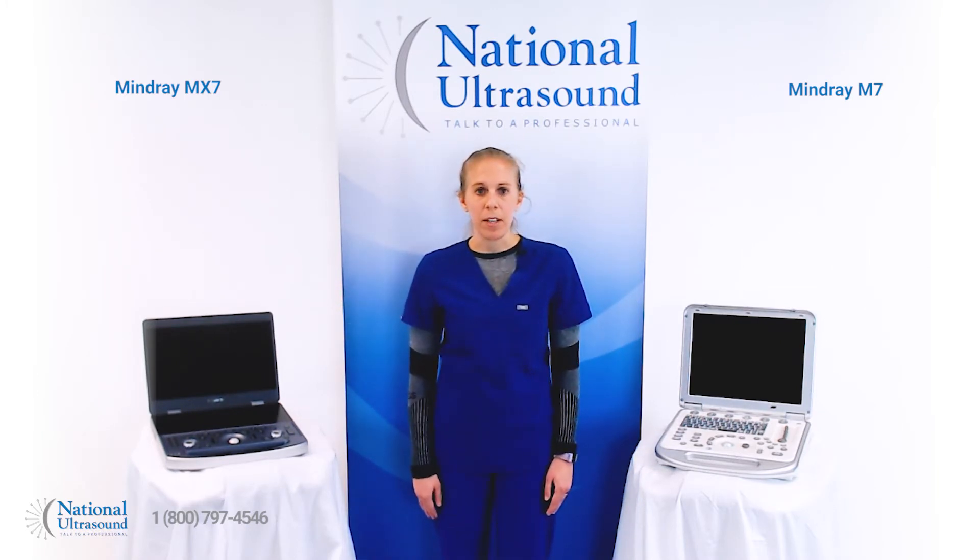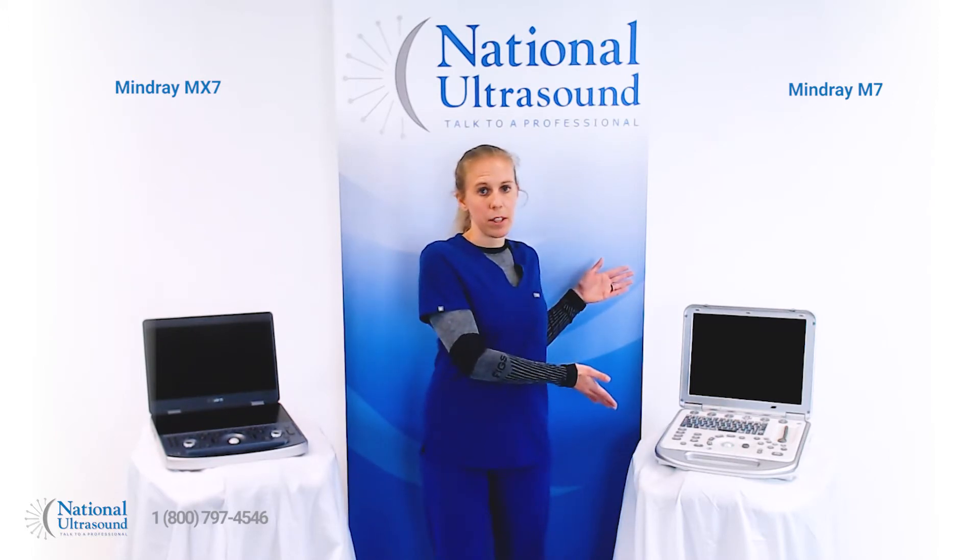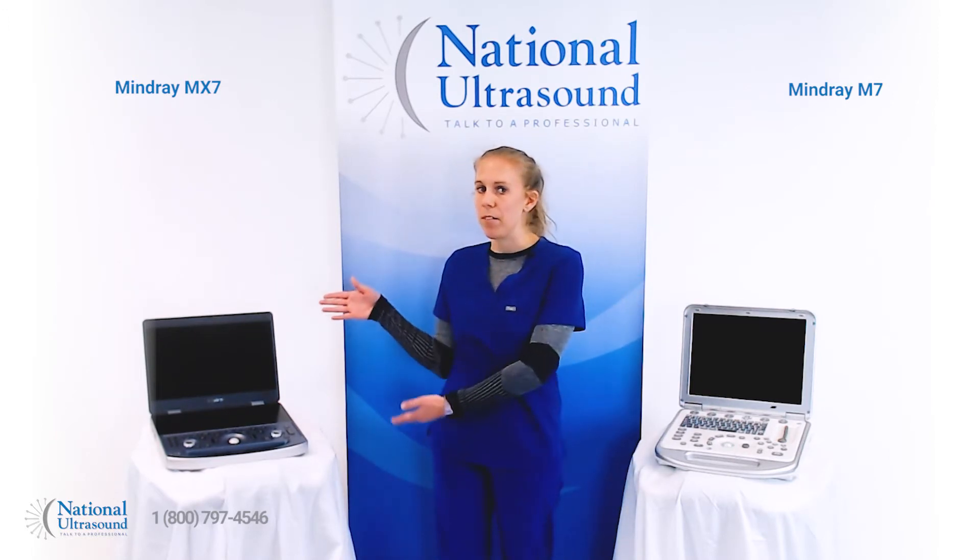The MindRay MX7 is a new upgraded model of the MindRay M7. We wanted to highlight the key differences between the original MindRay M7 and the new MindRay MX7 models.